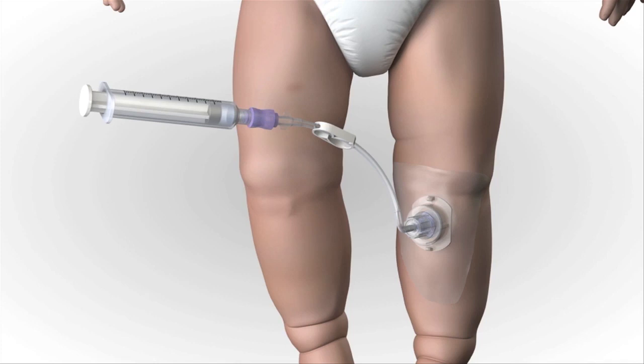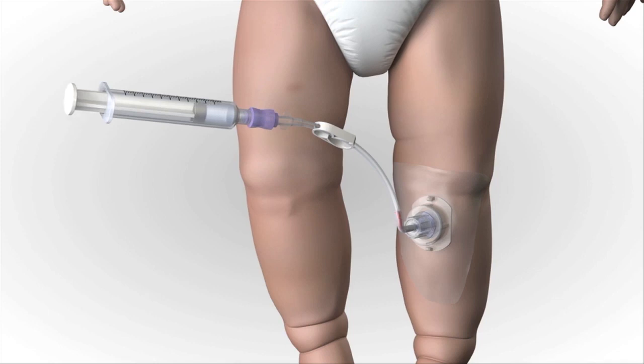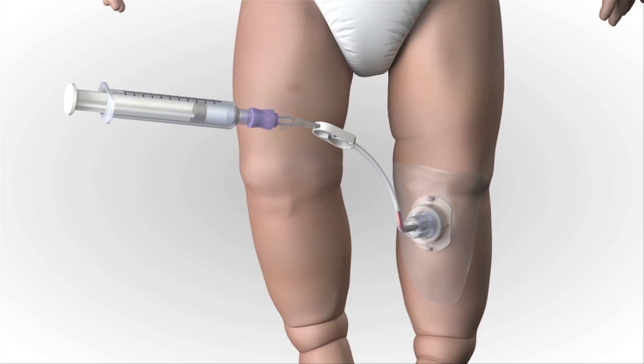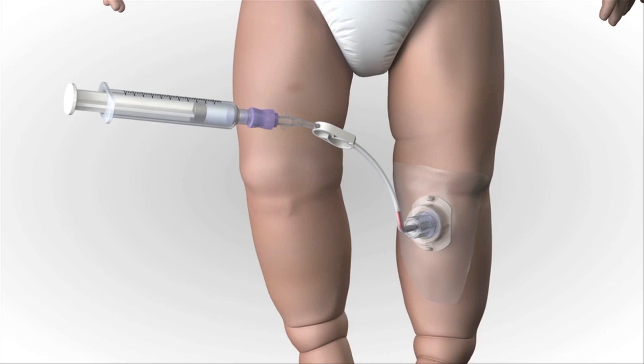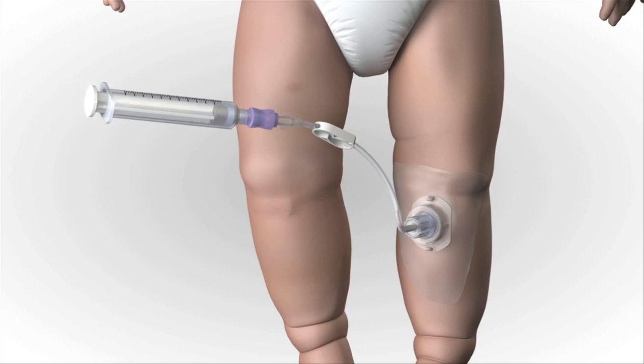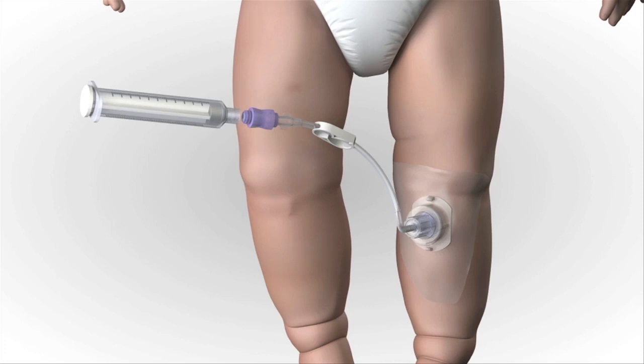Aspirate for blood and bone marrow. Inability to withdraw aspirate blood from the catheter hub does not mean the insertion was unsuccessful. Consider attempting to aspirate after the flush. Site placement can also be confirmed by the ability to administer pressurized fluids and noting the pharmacologic effects of medication administration after flow is established. Flush the catheter with 2 to 5 milliliters of normal saline.